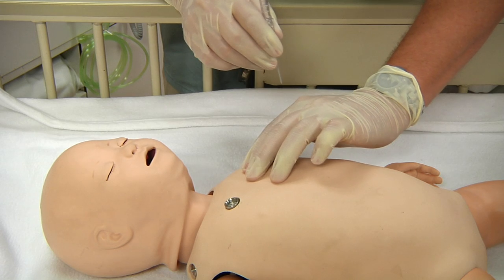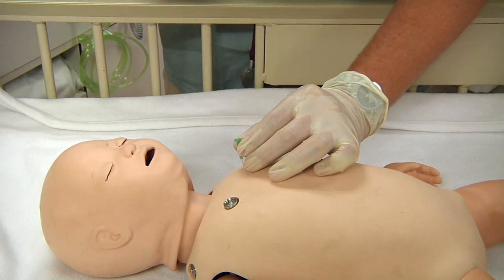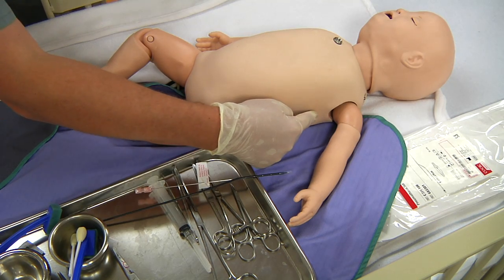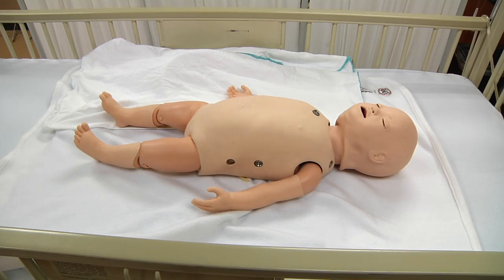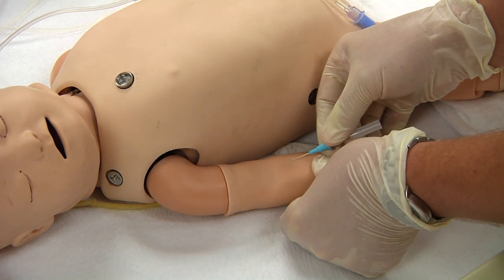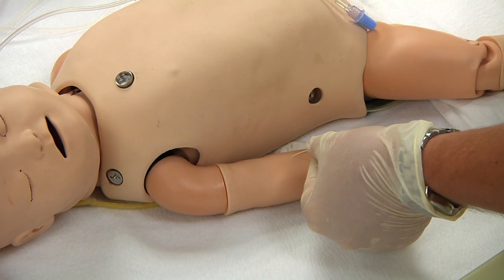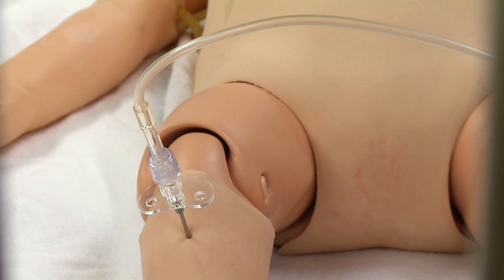A tension pneumothorax may be relieved by performing a needle decompression at the appropriate site. And a chest tube may be inserted on the mannequin's left side only. In simulations involving trauma, active bleeding may be present and should be controlled as you would control any other bleed. An intravenous line can be started in the right arm, through which fluids can be infused. Intraosseous access is also possible through the tibia in both legs. Drugs may be administered through any of these sites.